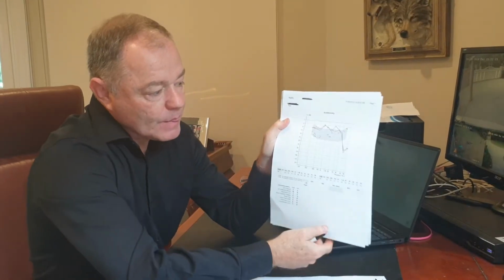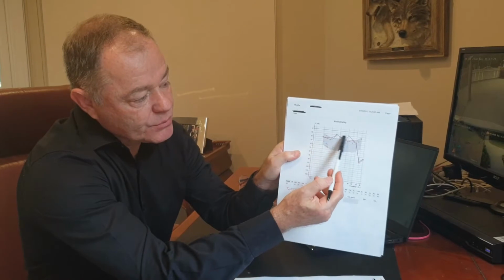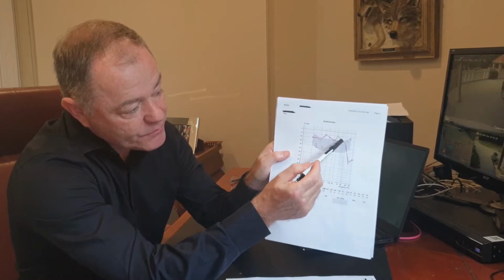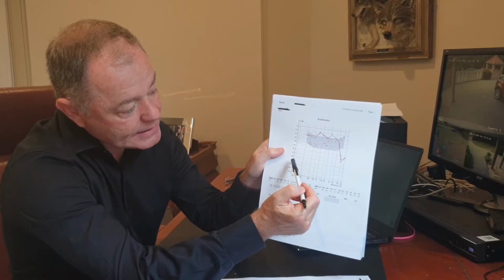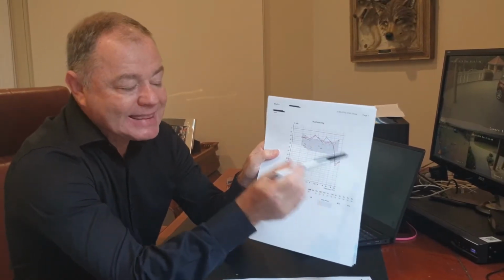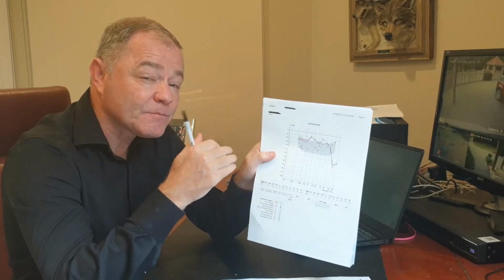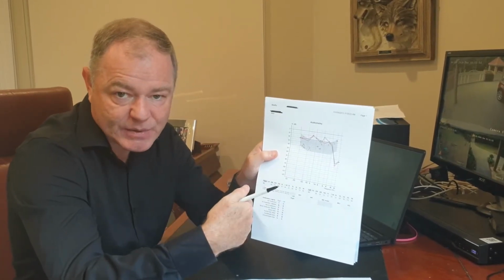So now when we look at this particular graph, it's not dissimilar to the original one. On these lower and mid frequencies, it's very much the same, but on the very extreme high frequencies, it takes a bit of a nosedive. And you can see it drops quite rapidly down to around about 80 decibels. Now, this is a very borderline case. It'd be very difficult to know whether or not we would want to correct this loss. It, to a large extent, will depend upon the issues that the particular client is experiencing.